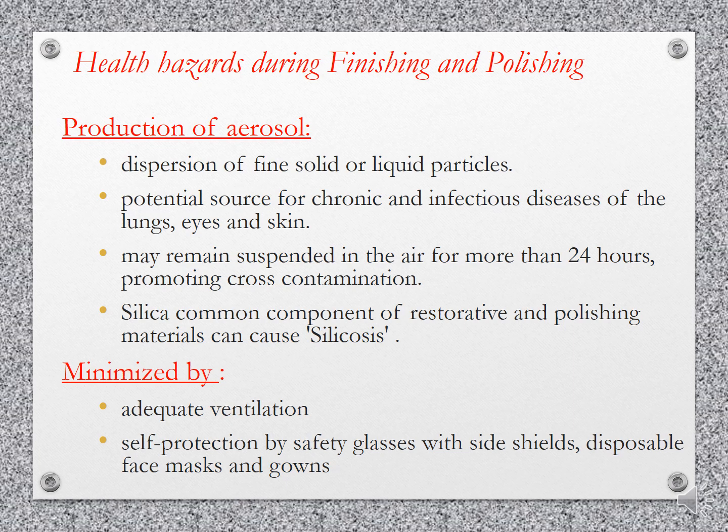Health hazards during finishing and polishing: production of aerosol, dispersion of fine solid or liquid particles, a potential source for chronic and infectious disease of the lungs, eyes, and skin, which may remain suspended in the air for more than 24 hours, promoting cross-contamination. Silica, a common component of restorative and polishing materials, can cause silicosis. The health hazards can be minimized by adequate ventilation, self-protection by safety glasses with side shields, disposable face masks, and gowns.